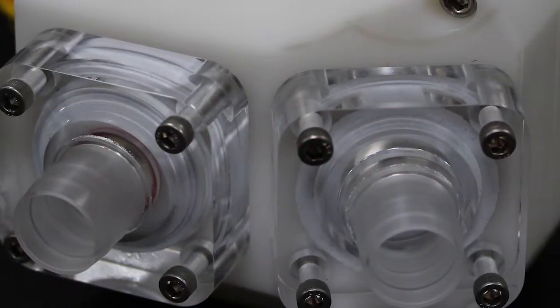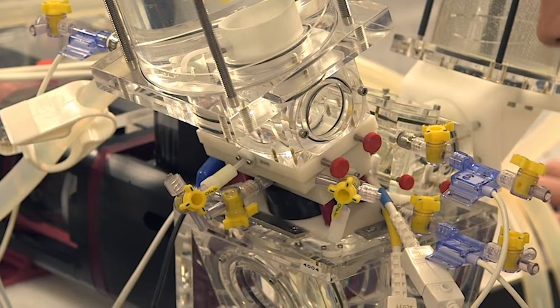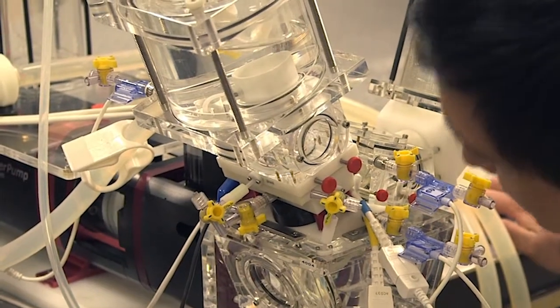An optional pump head assembly works with the Super Pump to create a physiological flow loop. A ventricle membrane works in conjunction with two simulated heart valves to regulate liquid flow.